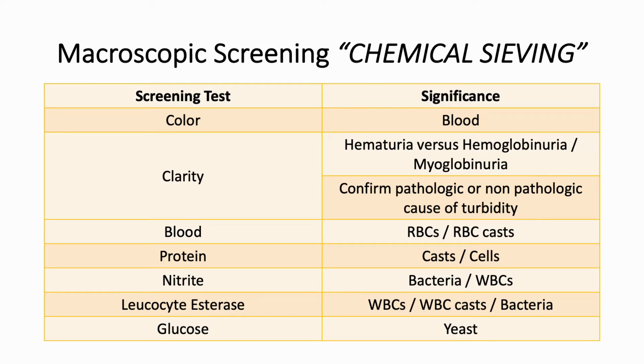Microscopic examination of the urine sediment is said to be the least standardized and the most time-consuming part of routine urinalysis. To enhance the cost-effectiveness of urinalysis, many laboratories have developed protocols whereby microscopic examination of the urine sediment would only be performed on specimens meeting specified criteria.